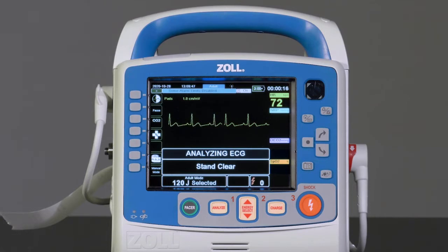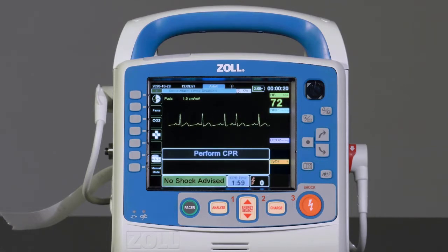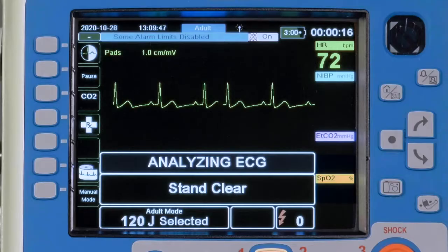A message will be displayed with audible prompts: Don't Touch Patient, Analyzing, followed by Analyzing ECG. At the end of the analysis, the No Shock Advised or Shock Advised message will be displayed and heard audibly.